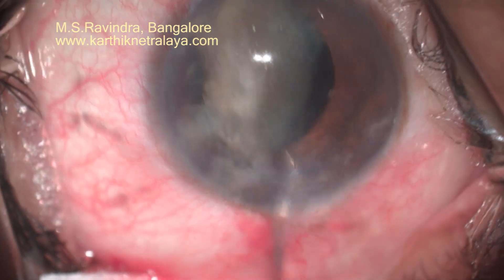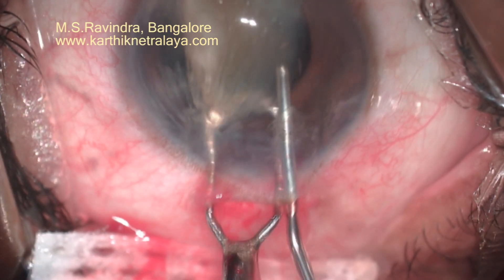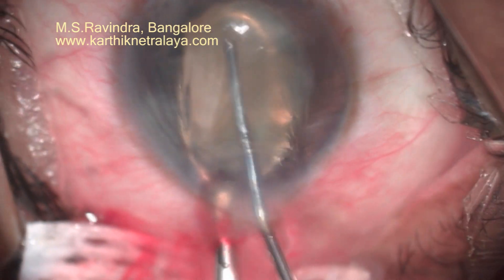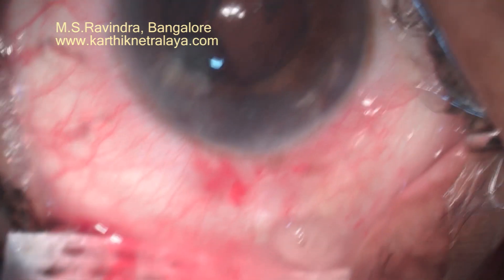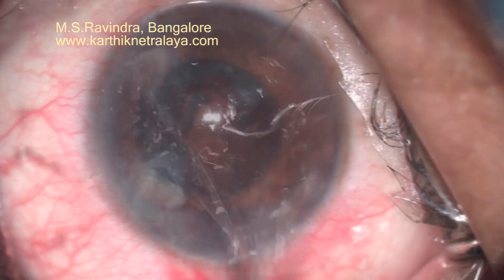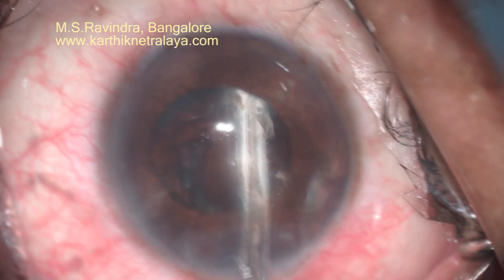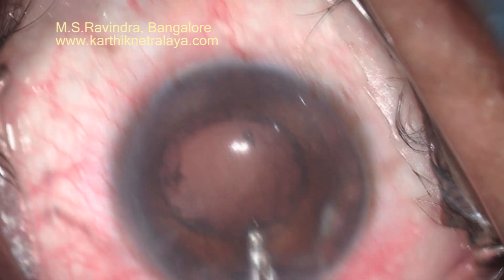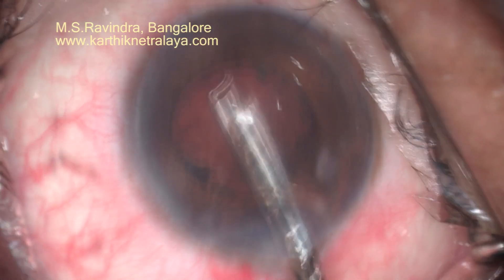One half of the nucleus is removed; the other half is aligned to the tunnel and removed with a similar mechanism. The 25-gauge cannula is continuously infusing HPMC into the anterior chamber, separating the nucleus from the endothelium. The leftover cortical and epinuclear pieces from the anterior chamber are initially removed.